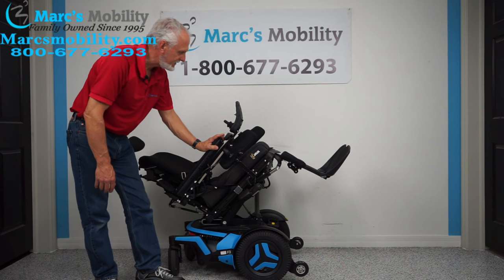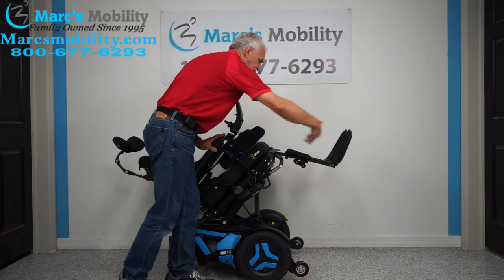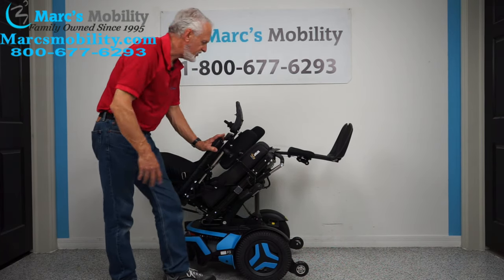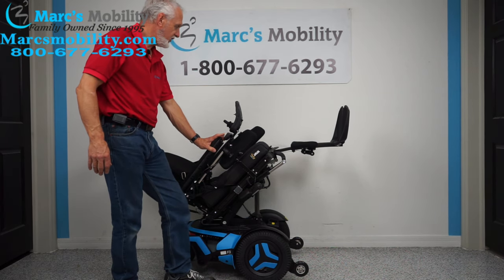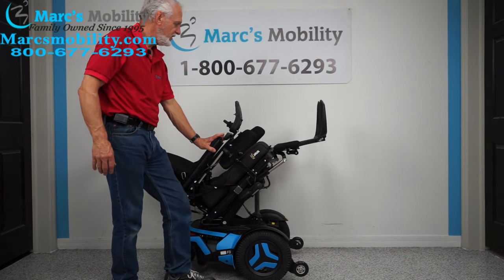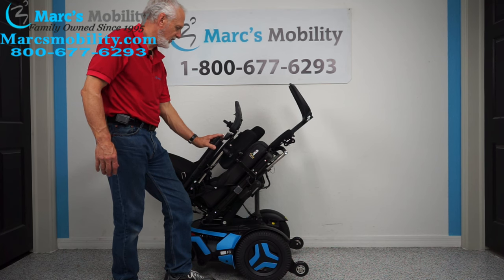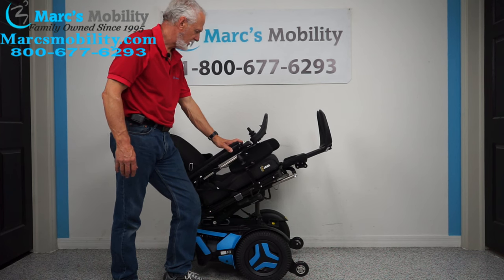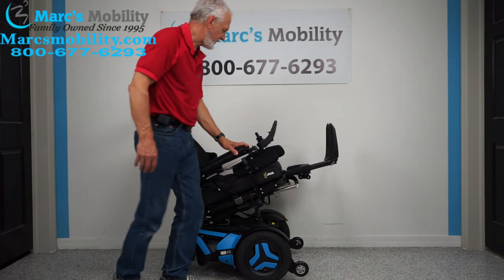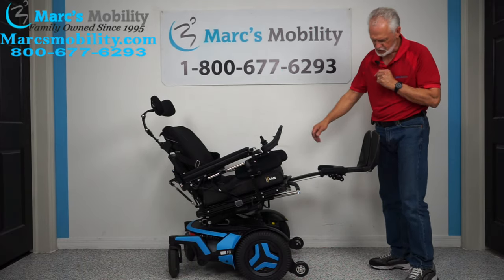The next thing is the legs. If you're five feet tall or six foot three, we can adjust these longer — these chairs are fully adjustable to your height and weight. So if you really want good circulation, I'll share the extreme position. If you're halfway tilted, your feet are still higher than your body.